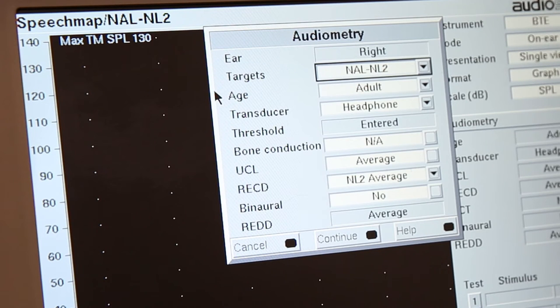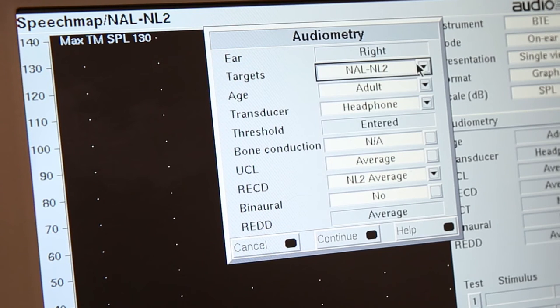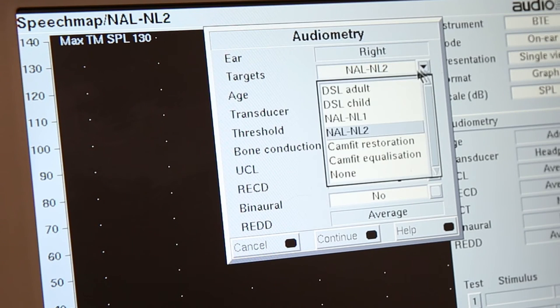So first you will select which fitting formula we use to program the aid. This will usually be DSL or NAL2.